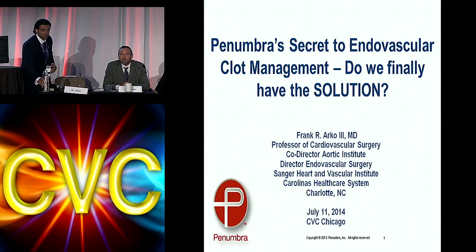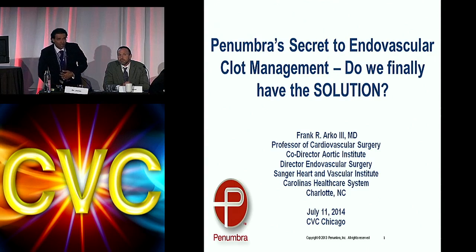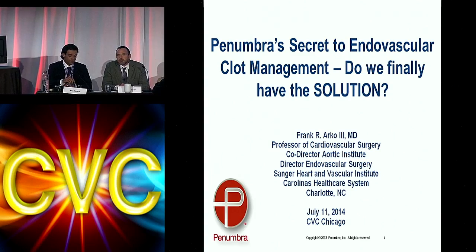Just a quick question. What is the internal diameter of the catheter, again? 1.67. Okay. And it doesn't taper down? It doesn't taper. Okay, so you can imagine this going down and the edge creating some sort of a cheese-cutting effect on the inside of the vessel. How do you prevent that as you're advancing it over the wire?